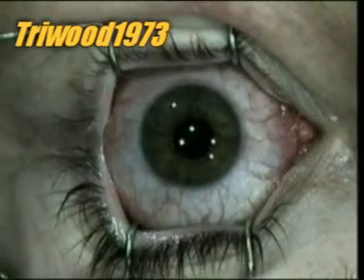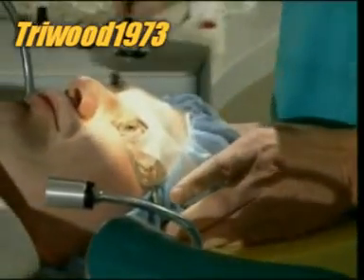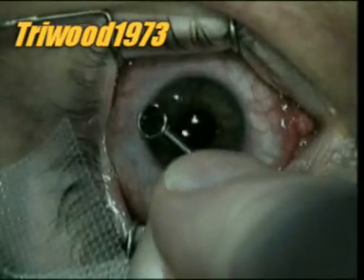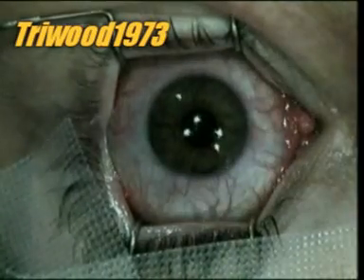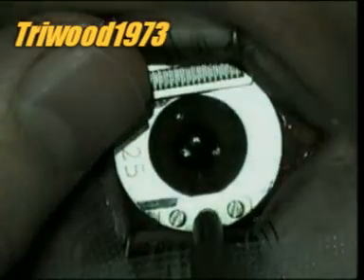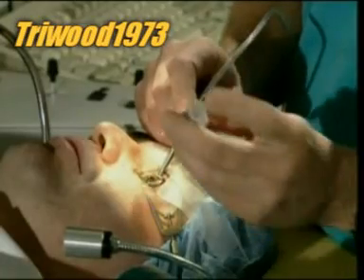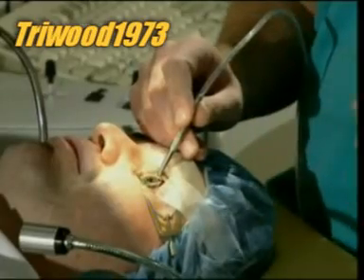The surgeon uses the speculum again to prop the lid open then begins the operation. The eye is marked with a sterile ink as reference marks to be used later. Next, a metal ring is positioned around the cornea. The ring is attached to a suction pump so it clings to the eye — like holding a tomato steady while you slice it — it holds the eye steady while the surgeon cuts the tissue.